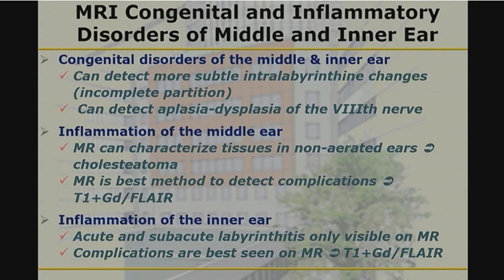Yeah, thank you. I didn't get a chance to talk about it, but a large part of what we do is actually trigeminal neuralgia imaging. And we have a paper submitted retrospectively where we've looked at that. Other people have published on this. And just contacting the nerve itself is not specific. That happens very frequently. The prognosis after treatment is much better if there's actually deformity of the nerve.